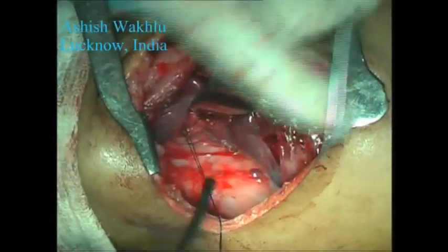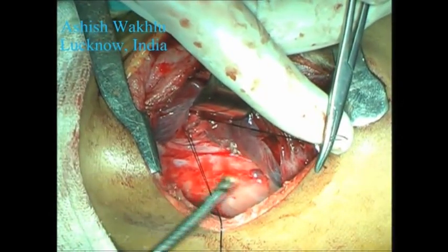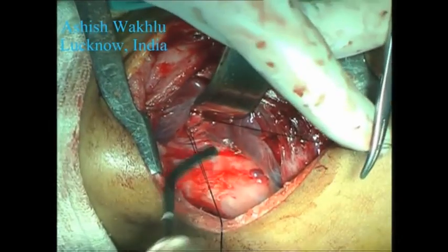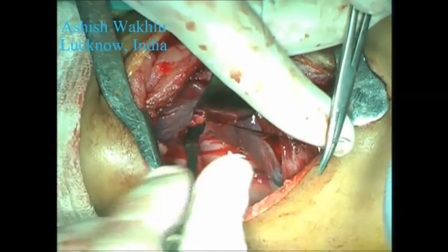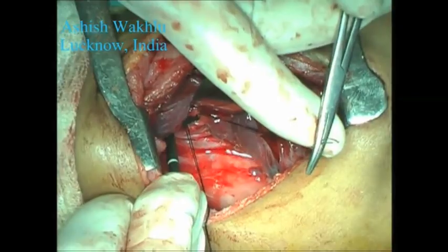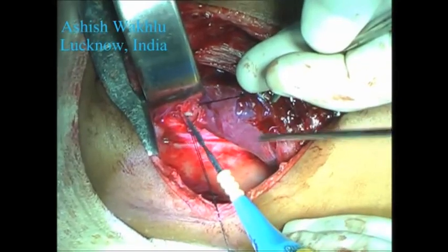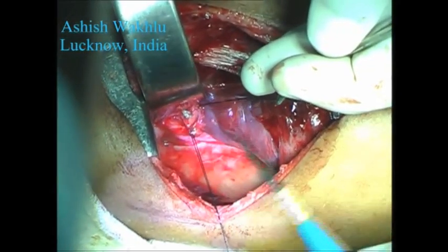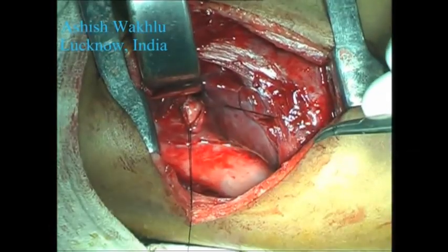We are here attempting to introduce a flexible bronchoscope into the bronchus of the right lung to see whether the remaining distal bifurcations are patent. Unfortunately, as the size of the bronchus was too small to accommodate the bronchoscope fully, we could not get a clear picture of the situation inside.